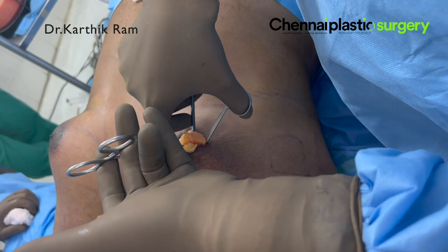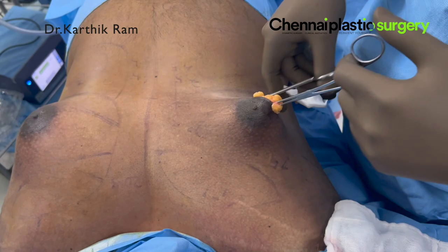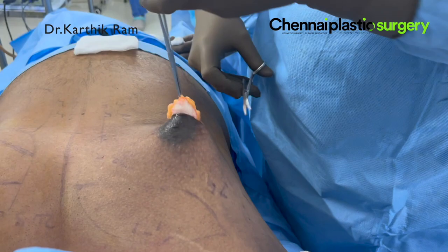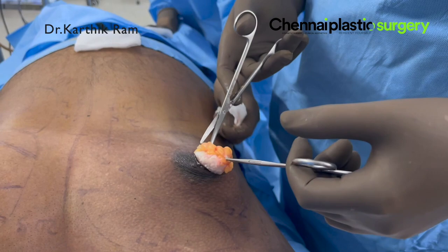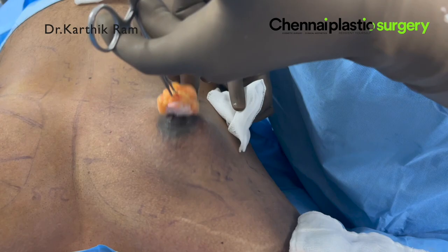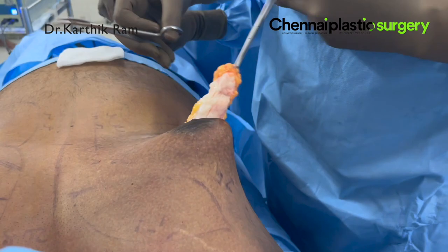Give a firm pull over the gland and introduce your scissors. Because of the pull, you won't injure the muscle. When you keep going inside, a plane is created below the gland. You create the plane using scissors — that is the plane between the muscle and the gland — so you won't injure the muscle easily. It is a little blind step, but that plane will open up easily. Now I am only going and releasing the plane everywhere below the gland. If it is a big gland, don't try to remove it as one big mass. You can do it piecemeal — nothing wrong. Because if you try to pull the whole gland through the small cut, you might tear the skin margins. Sometimes you need to divide the gland in the middle and remove it in two or three pieces.